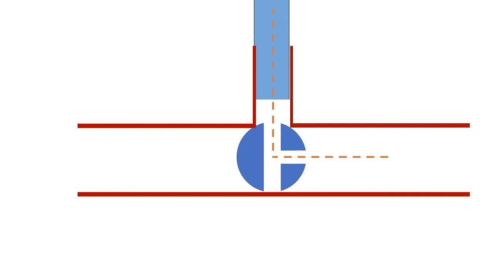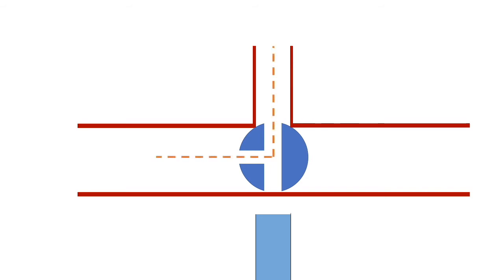Now we can communicate between the side arm and the port to the right, as you see here. And turning the handle down, as you see here, will allow for communication along this path.